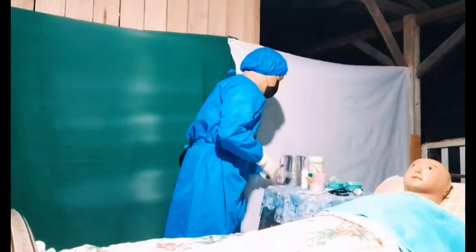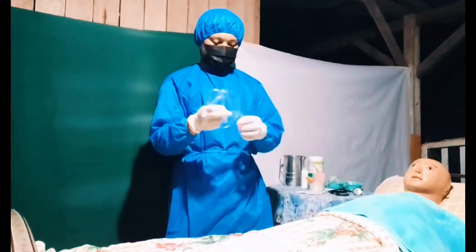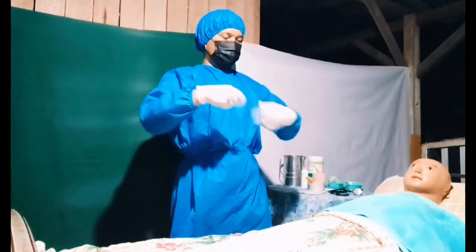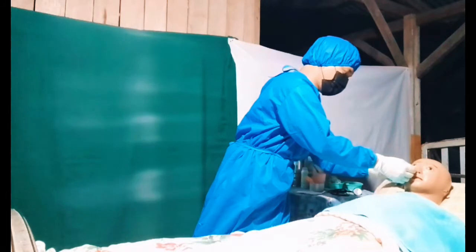We have the NGT tube. Measure from nose to ear and from ear to the stomach.